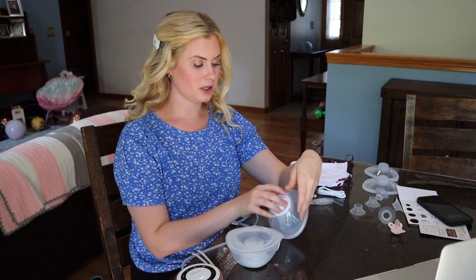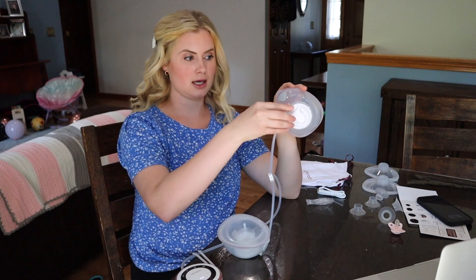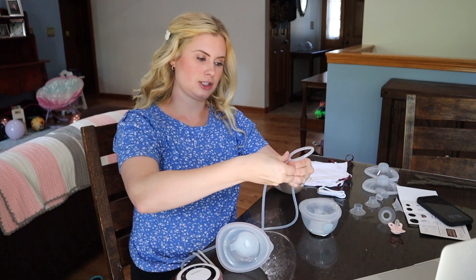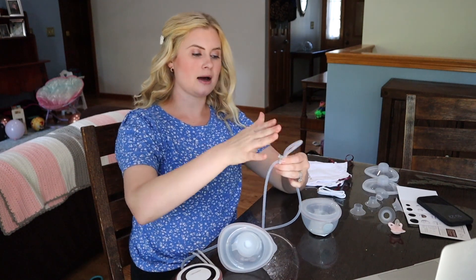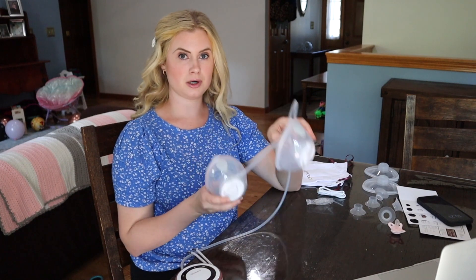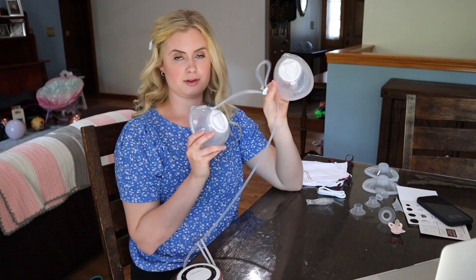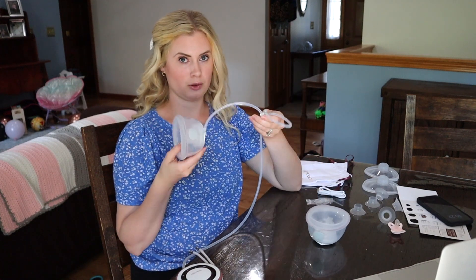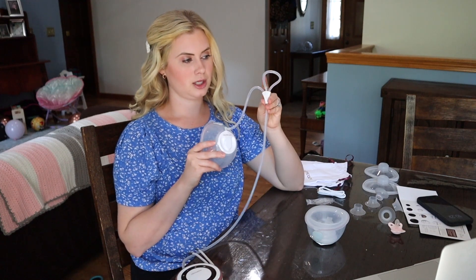The settings I prefer were massage mode at level six and then expression mode also at level six. It has nine different levels. If you want to single pump, disconnect one of the tubes and place that tube in the center — this stops that side from suctioning. It won't work if you just leave both connected without doing this, because the unattached side will have no suction. So make sure you do this if you need to single pump.